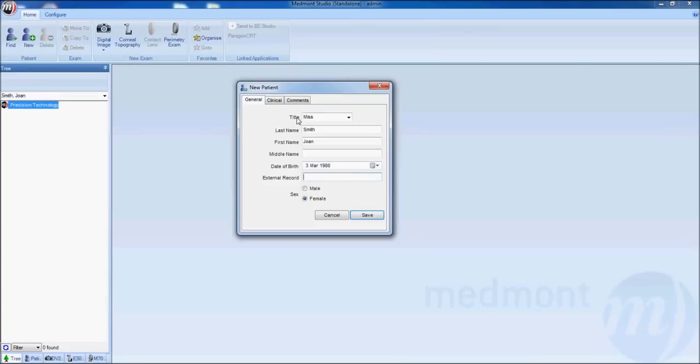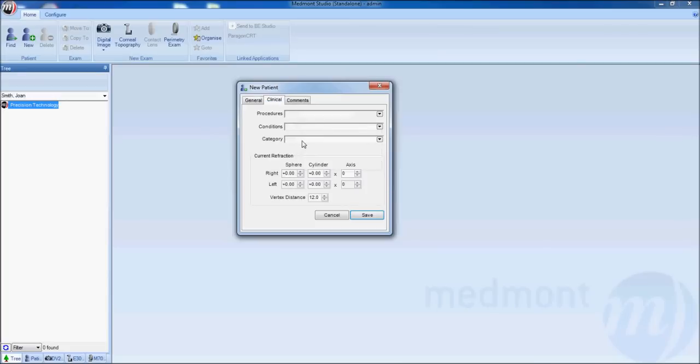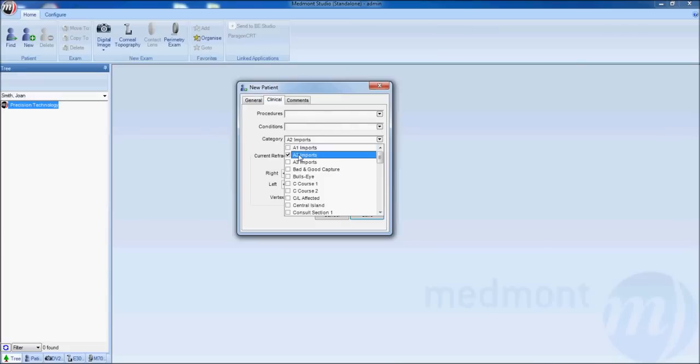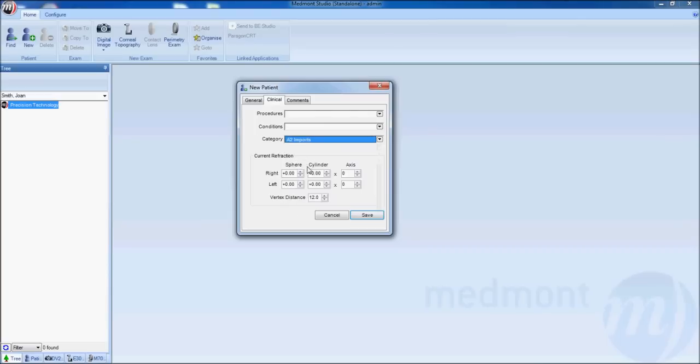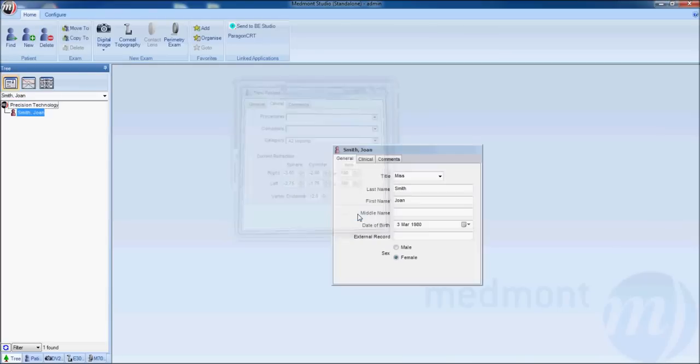Select the gender. If you're designing an E300 contact lens you can enter in the patient Rx on this window. When you're ready click save.